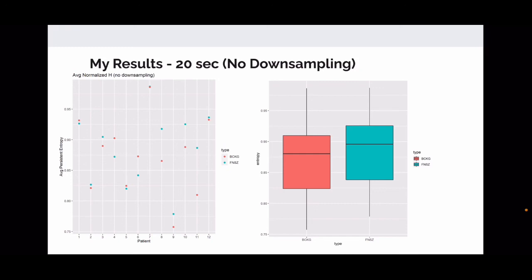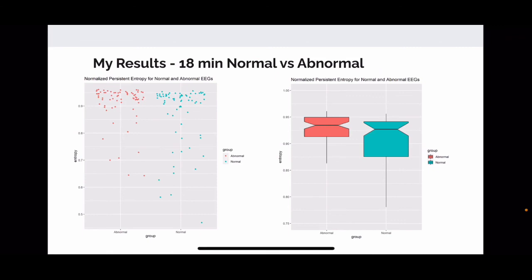So. Okay. And then the final one is the normal versus abnormal, where the abnormal might not necessarily be a seizure EEG. It could just have delta slowing and not exactly have a seizure. Yeah. Okay. We're going to try and replicate Piangerelli's studies more closely with adult EEGs because he did it with pediatric EEGs, right? So we're going to try it with adult EEGs next. And then we'll see if we can replicate his results and see if there's a threshold number, where if it's above this, then it's normal, and if it's below this, then it's abnormal. All right, it's a good plan.